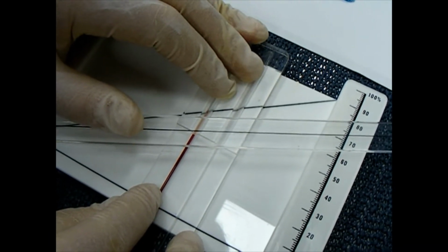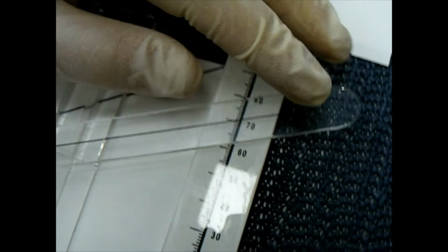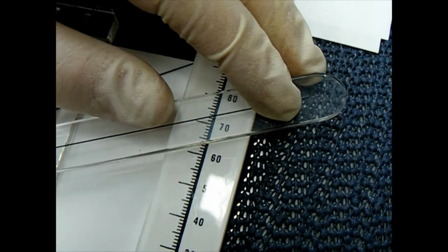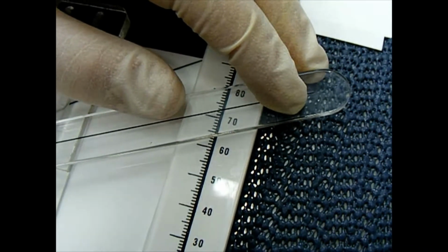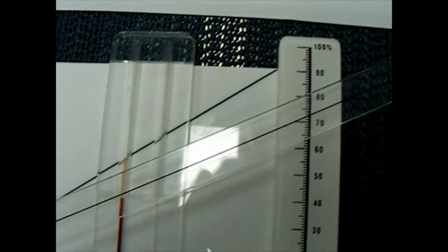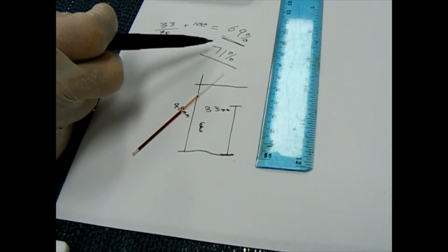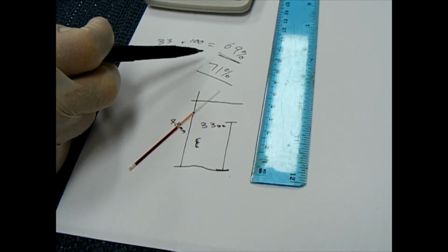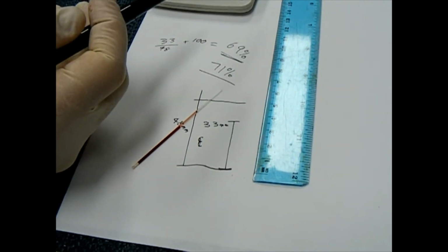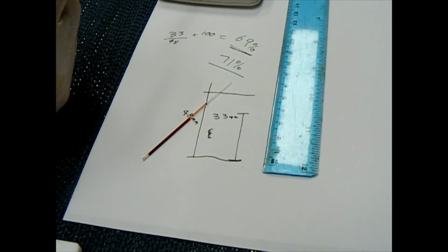Okay, you go right on top of the red blood cell level, and then you go over here and you read the number. Now, that number is 71. That's what I read that as, 71%. Now you can see it's not exactly what we got manually, but it's very, very close. 1 or 2% out is acceptable. So you should do both, and you should compare both the manual method and the manual reader.